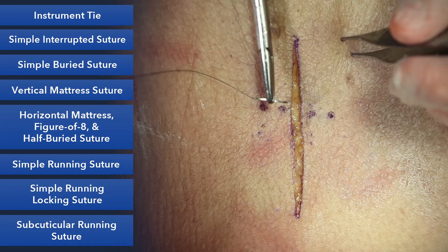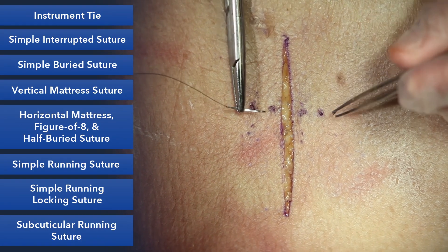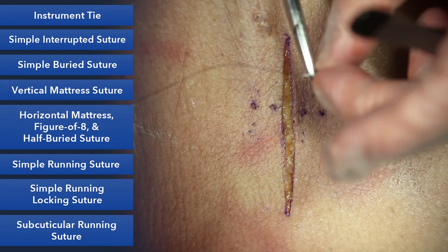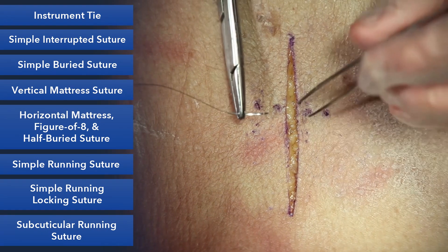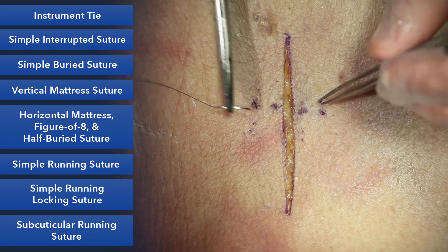Next is the vertical mattress suture. The vertical mattress suture is a very useful suture, especially when wounds are hard to close if they're under a lot of tension, or maybe there's a lot of swelling or you anticipate swelling. It's especially valuable when skin tends to roll in and you want to evert the edges.